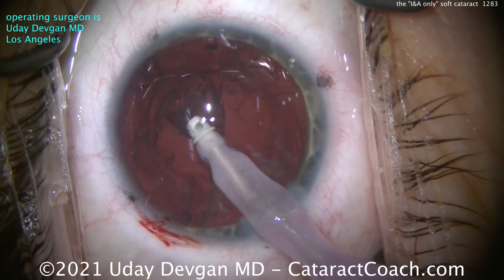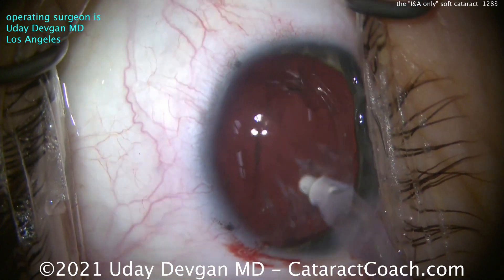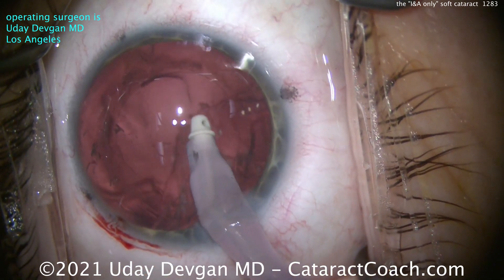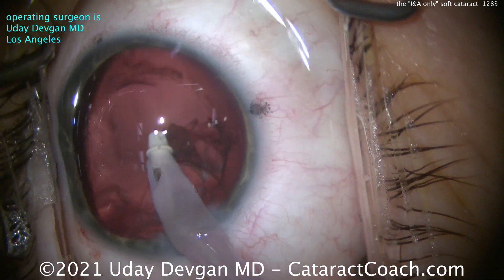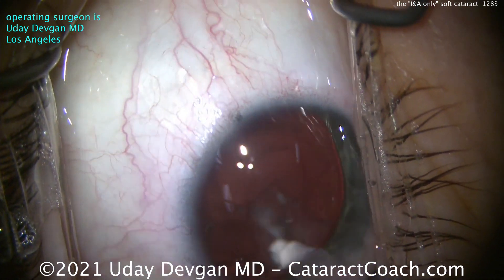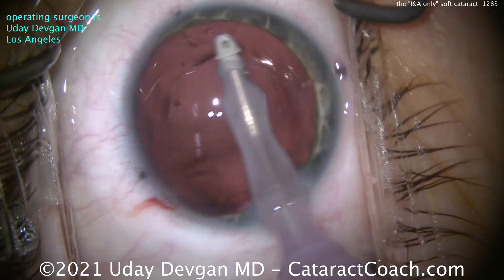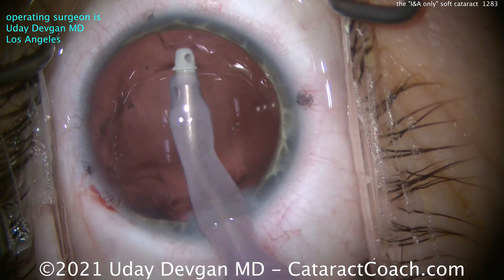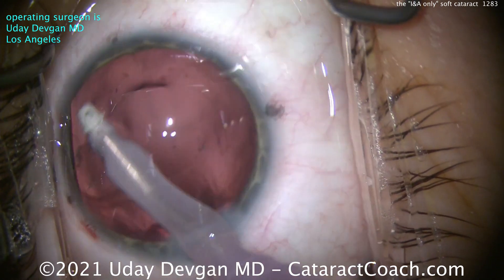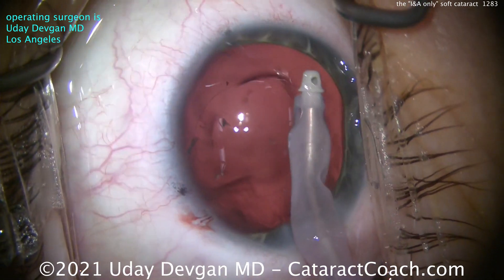Let's clean up the capsule — this is going to take a little bit of extra time. We're going to show you the complete cataract case unedited. The nucleus is gone, but the cortex cleanup is probably the more important part here. We'll do it little by little in all the quadrants, and we'll also do some polishing on that capsule bag. We'll get all that stuff off the undersurface of the anterior capsule rim. What are the odds the patient's going to need a YAG laser capsulotomy for posterior capsule opacification in the next year? It's pretty high, no matter how much polishing we do.